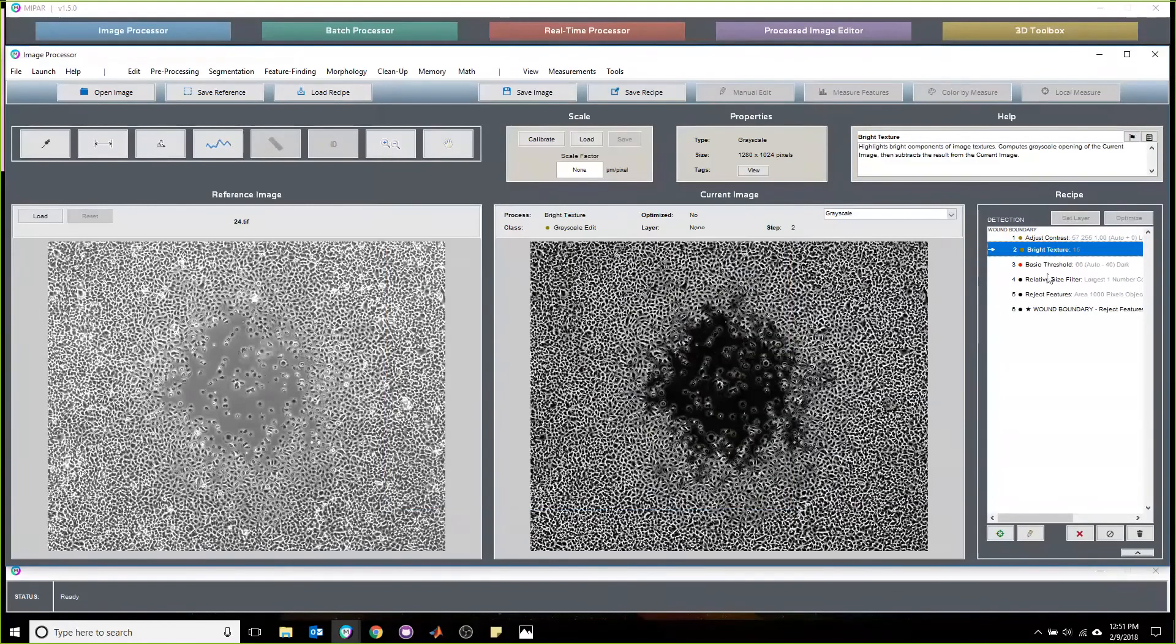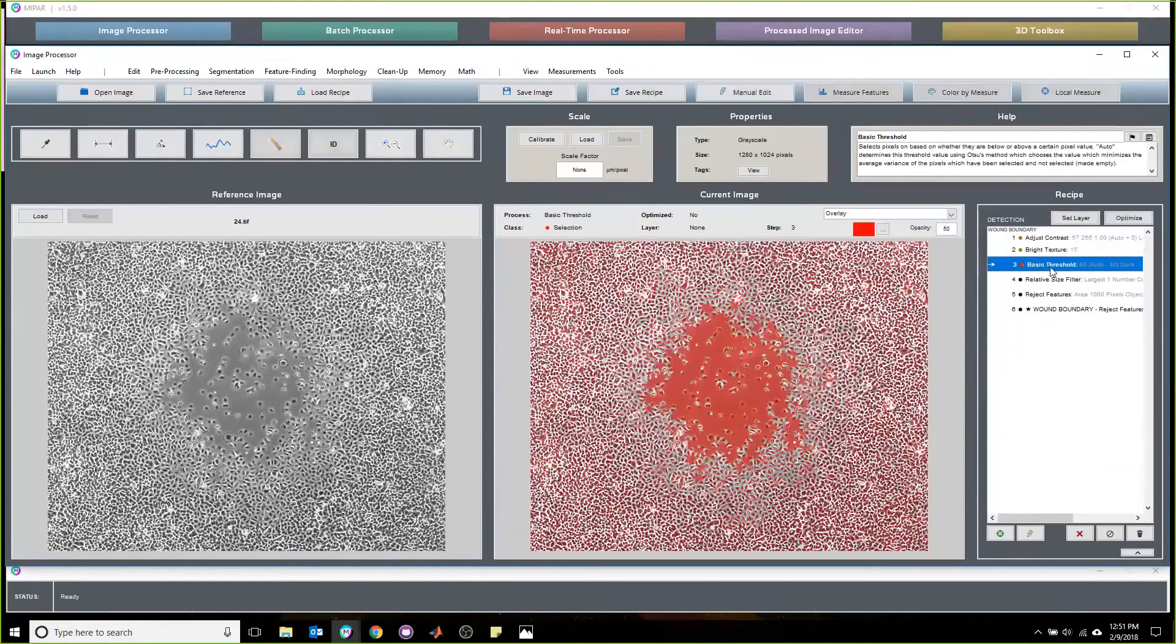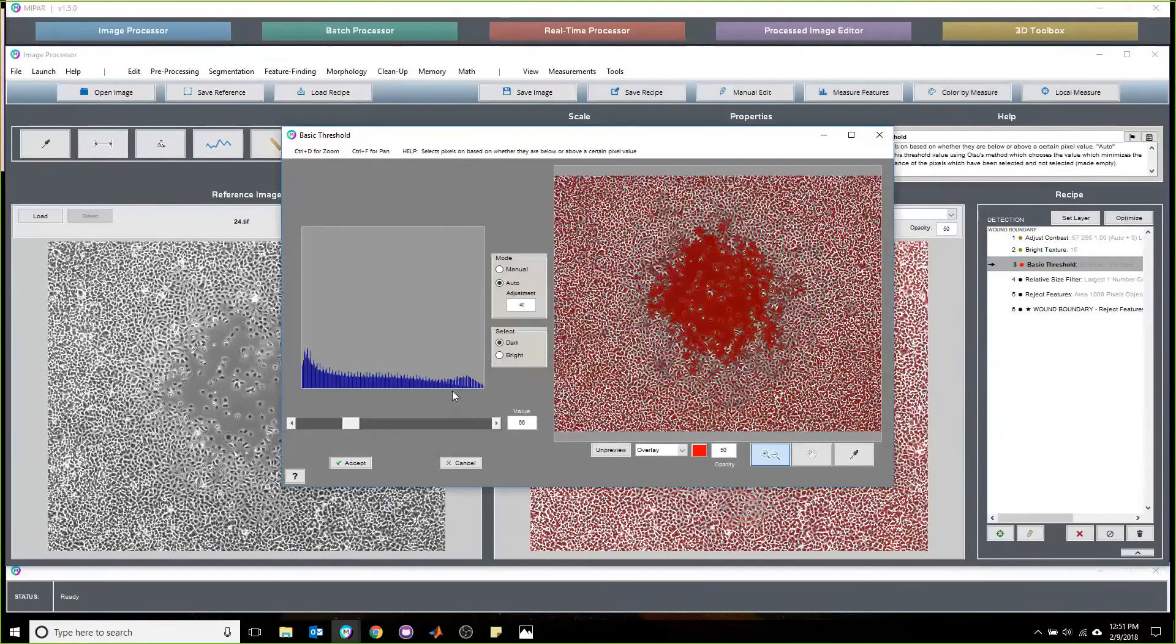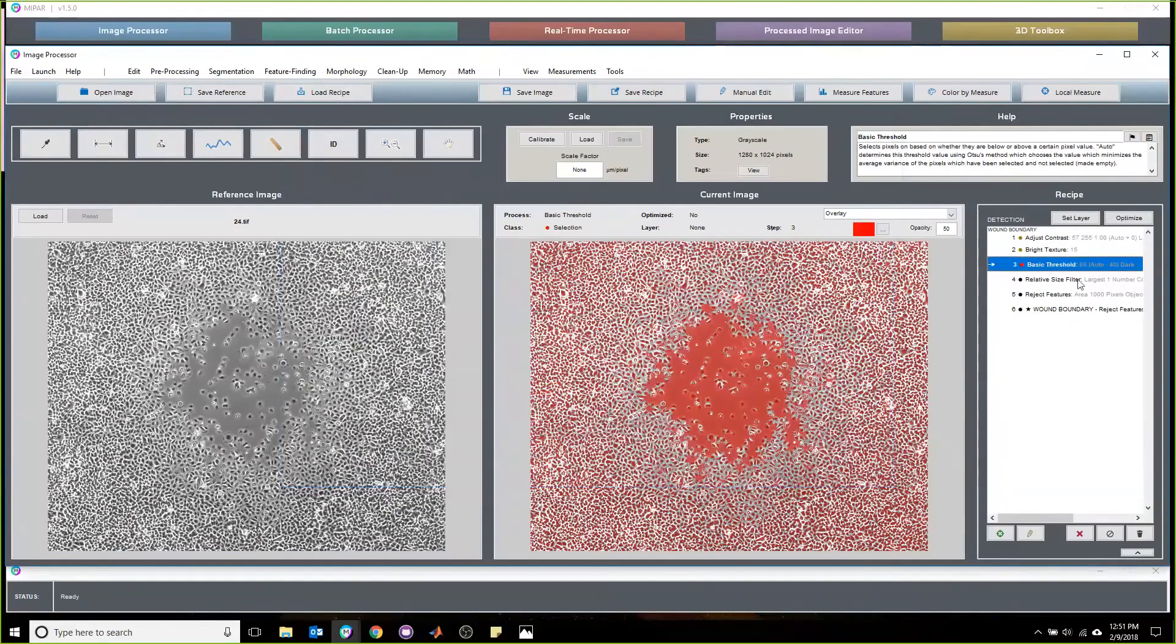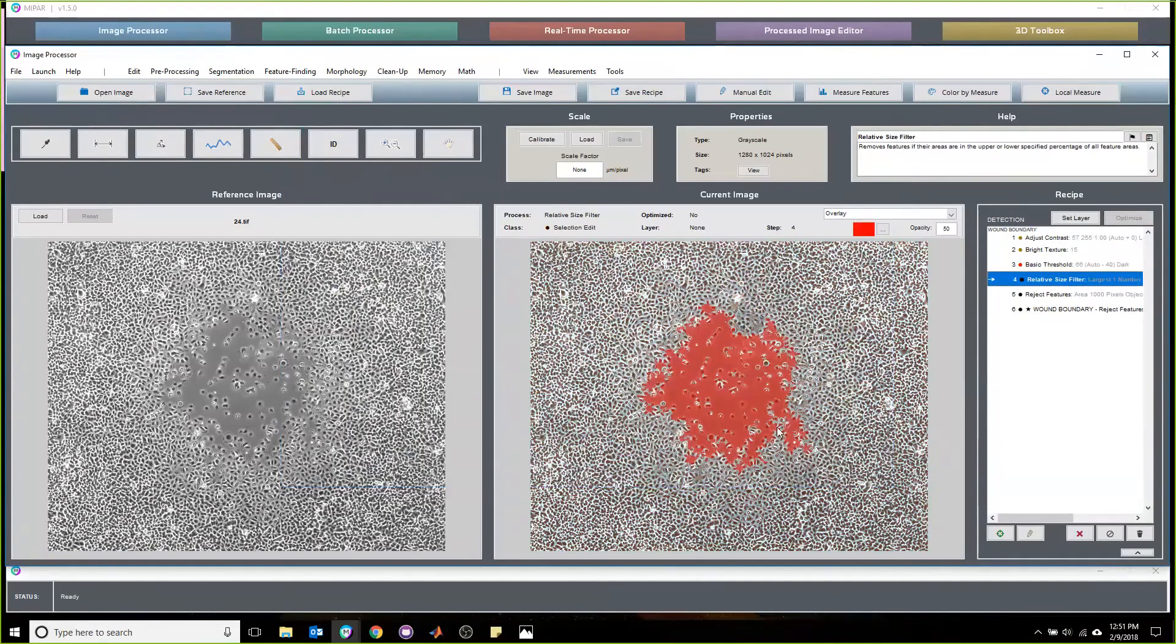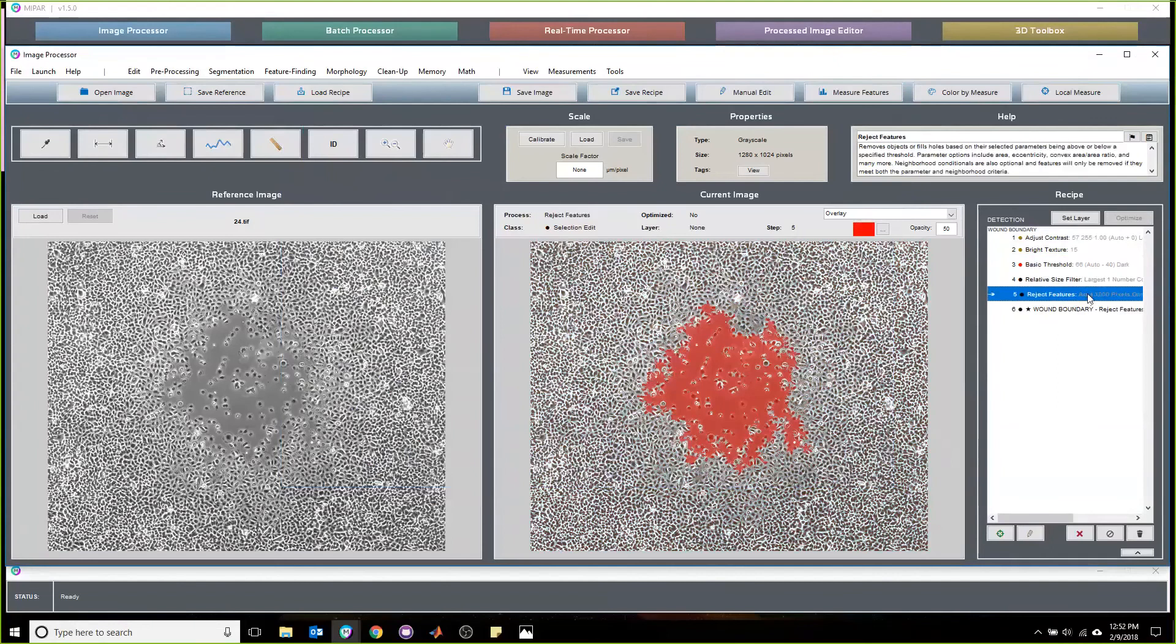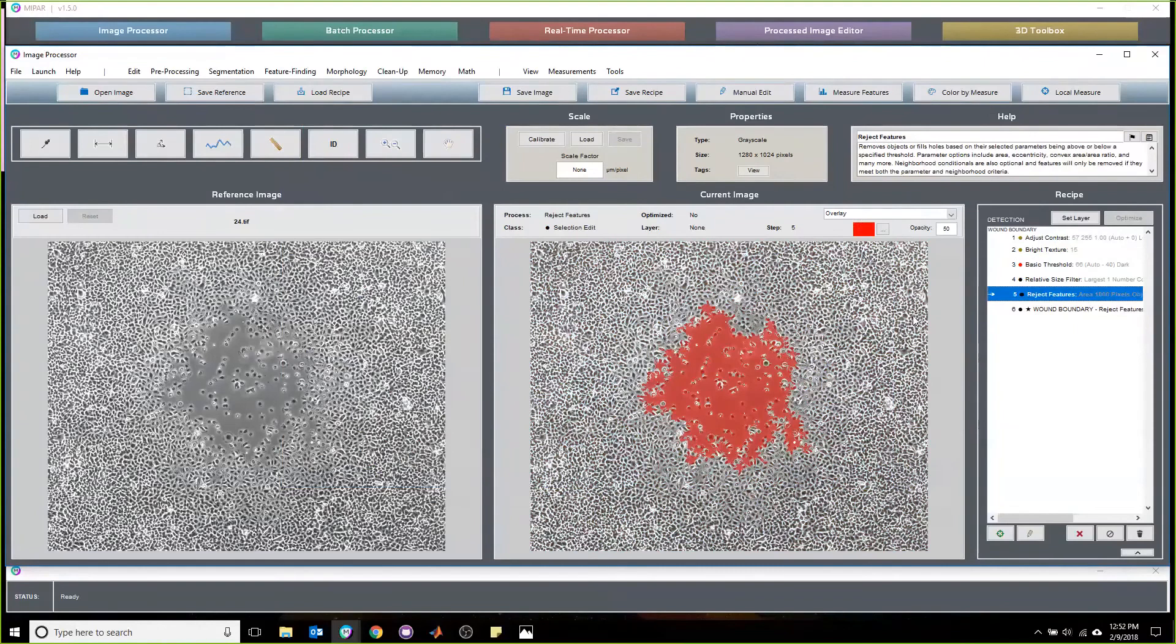From here, we apply a simple threshold that is adjusted, looking for dark features. We then pick up the largest feature and apply a cleaning step to remove anything in the edges that will have been picked up.